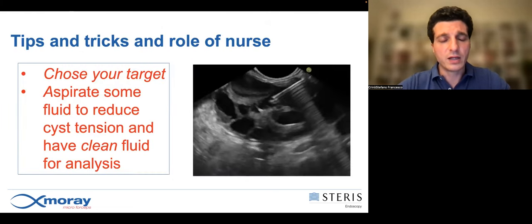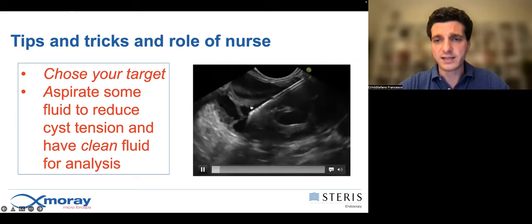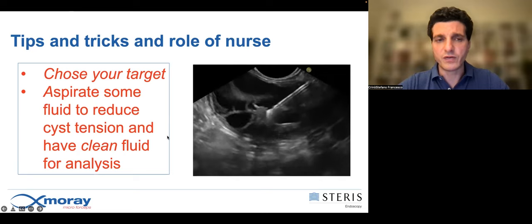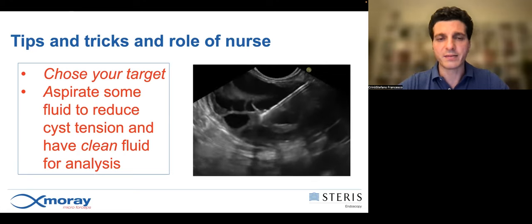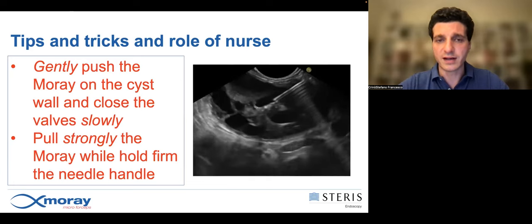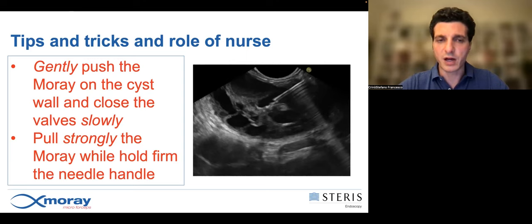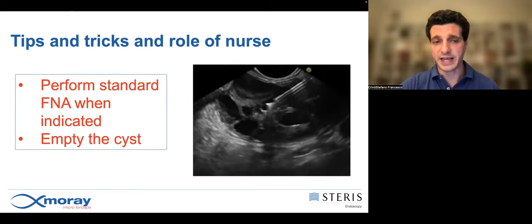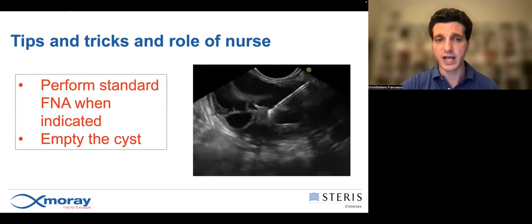Moving to the second point: tips and tricks of through-the-needle biopsy. First, you have to choose your target — in this case, a thickened septum. You have to aspirate some fluid to reduce cyst tension and obtain clean fluid for analysis. Then gently push the Moray micro forceps on the target and slowly close the valves. Sometimes you must pull the micro forceps off strongly, but hold firmly the needle handle to avoid the risk of getting out of the lesion. You can also perform standard FNA if indicated, and most importantly, don't forget to empty the cyst.